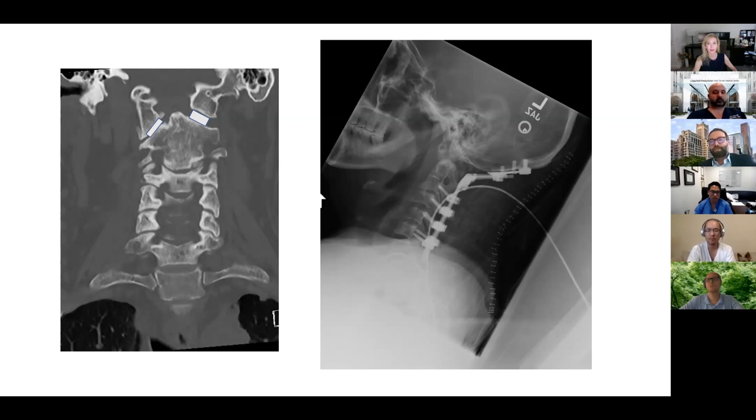I like hinged rods, to be honest, especially when you have an acute craniovertebral junction angle. This one is not acute, not obtuse, but if it's acute, let's say 90 degrees, when you bend the contoured rod so much, at 90 degrees, that would invite fatigue failure. It may break because you're going into the plastic phase of the rod. So I like the hinged ones because you hinge it and then you lock it there. That's the advantage, and I think for acute bends that would invite fatigue failure.